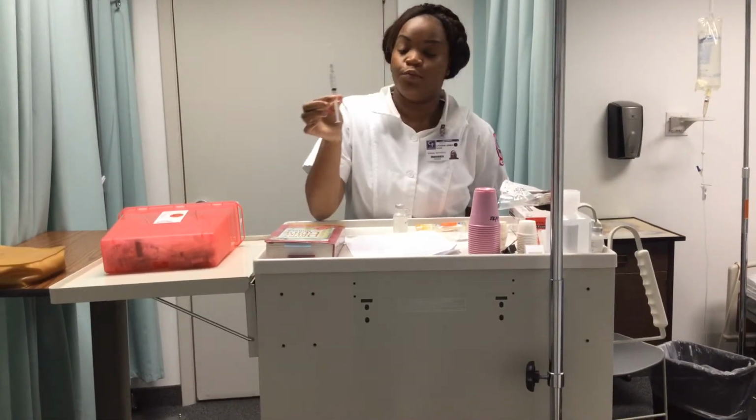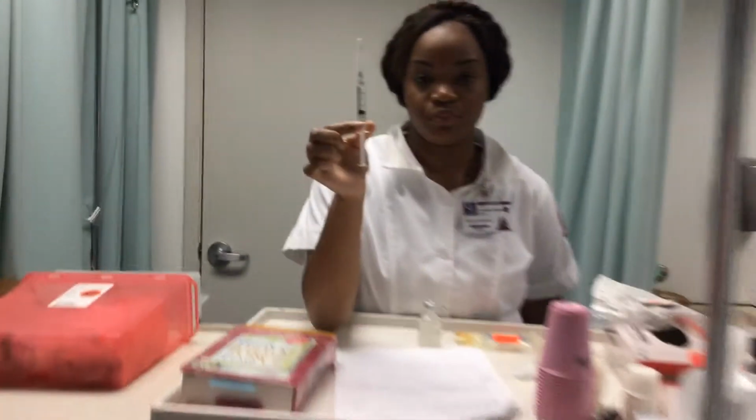Recapping, I have withdrawn 2 mLs of medication. No air bubbles, contents are clear.